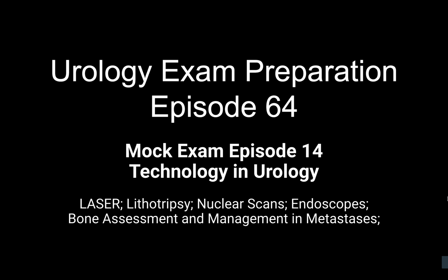What may be the radiation exposure during a DMSA scan? DMSA scan radiation exposure is about 1 millisievert. Okay, how does it compare with, say, a CT scan or normal background exposure? The normal yearly background exposure in the UK is about 2 to 3 millisieverts, which means the DMSA scan is equivalent to normal background exposure of about 3 to 4 months. Compared to a CT scan, that is about a tenth of what one may be exposed to when a CT scan is done.